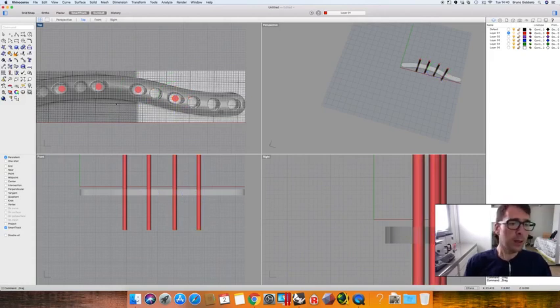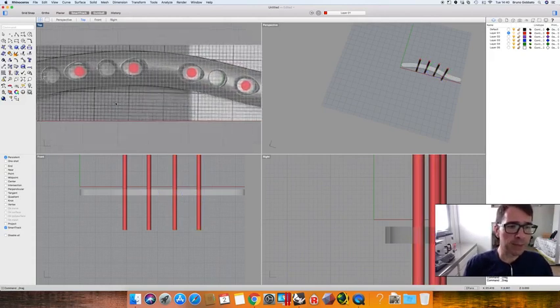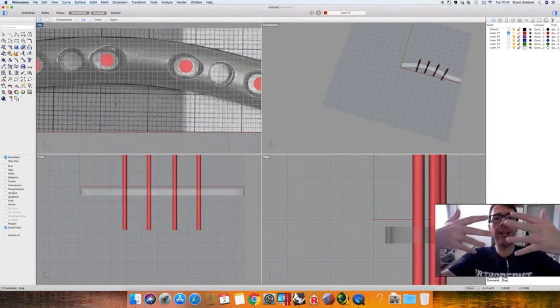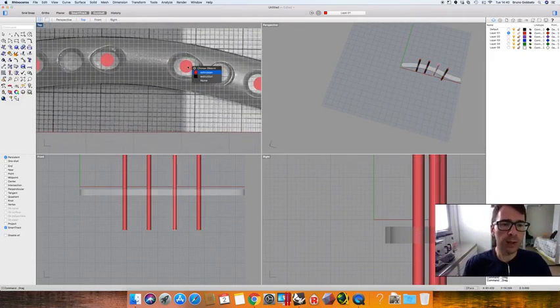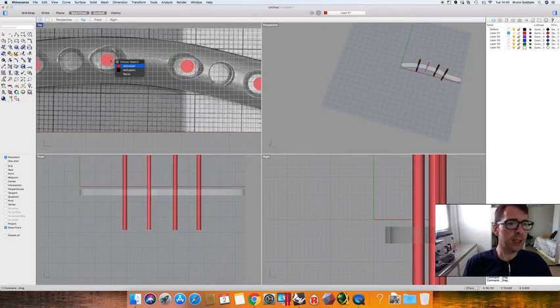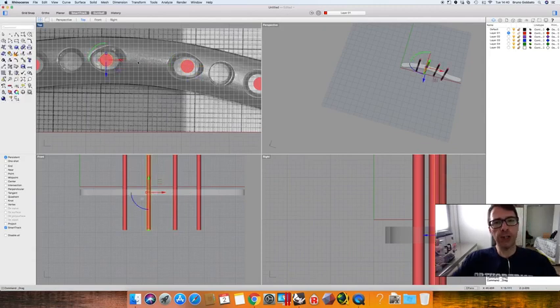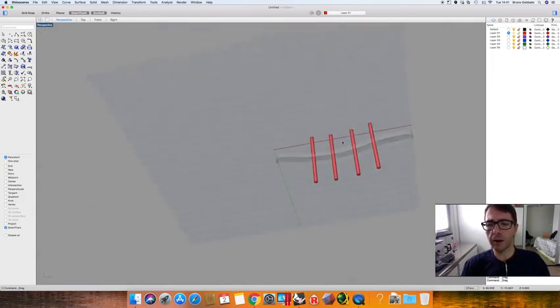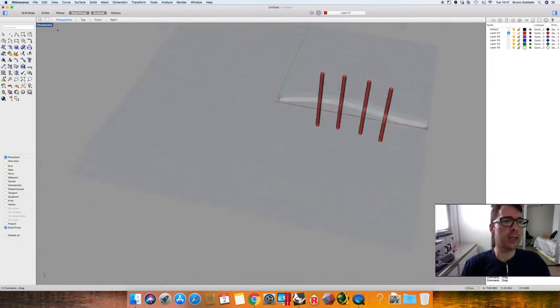Okay, here we have some tips. If we want to do a compression, we can move these 2 screws a little more distally, as you can see here, a little more distally, and we will have more compression when we tighten the screws. Okay, and now we already have our implant with 4 cortical screws, as you can see here.